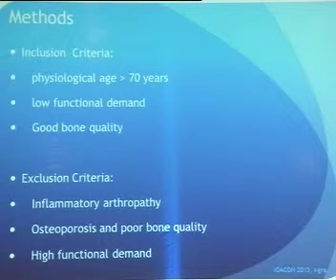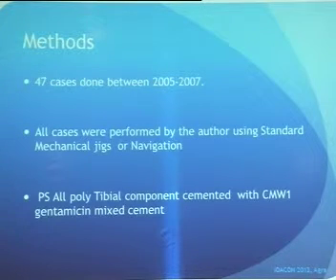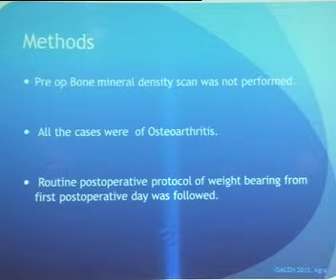Inclusion criteria were physiological age above 70 years, low functional demand, good bone quality, exclusion criteria being inflammatory arthropathy, osteoporosis, poor bone quality, and high functional demand. 47 cases done between 2005 and 2007. All cases were performed by myself using standard mechanical jigs or navigation. PS, all poly tibial components cemented with CMW1 gentamicin mixed cement. Pre-op bone mineral density DEXA scan was not performed.